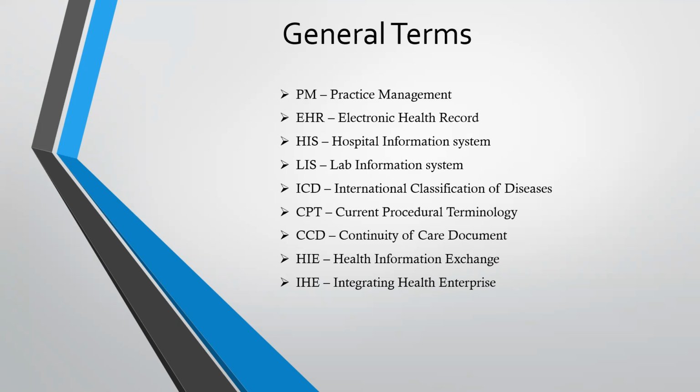So we need to be aware of a few general terms. A few of us are not from a healthcare background. So these terms are the ones which we will be extensively using down the line throughout our training. Let's quickly understand them. PM or PMS is practice management system. This is software that is used by the front end staff or the receptionists to handle patients, register patients, register their details, create appointments, and manage doctors' appointments, calendars, and all. So apparently, it is managing the entire hospital. Hence, it is called a practice management system or practice management application.